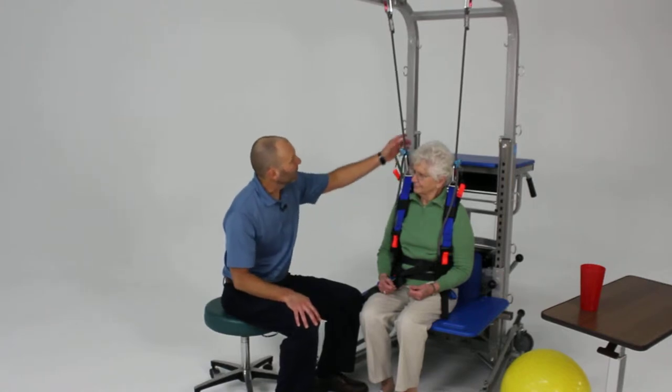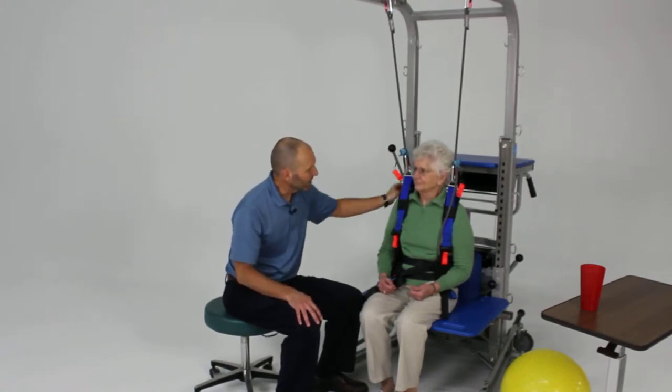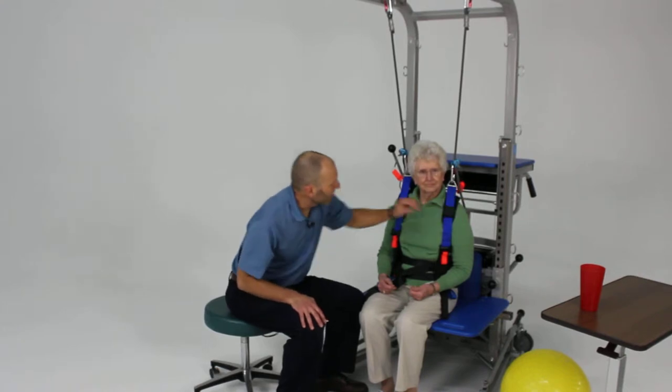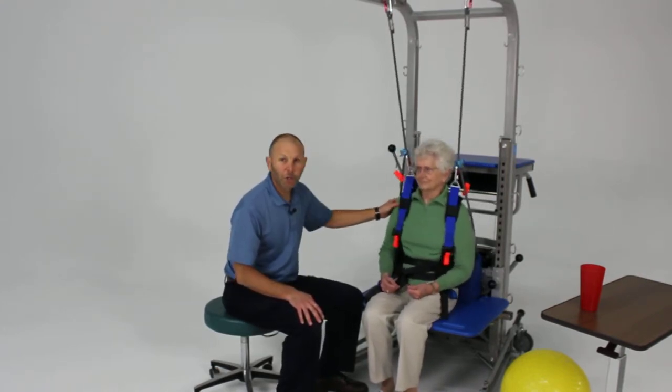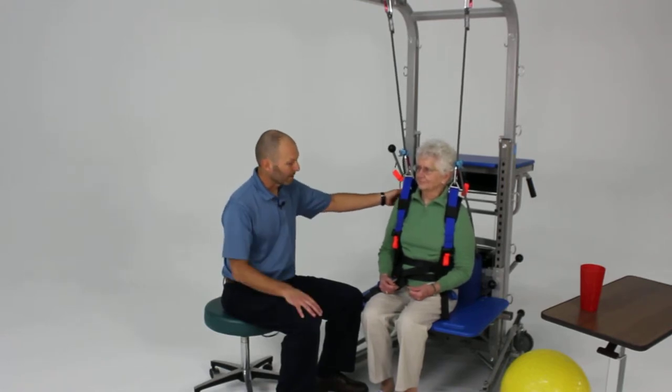We have our balance harness also in place here that provides some limits when they're going to be doing their balance activities. It gives them a checkpoint and gives them some security that they can do their balance activities.